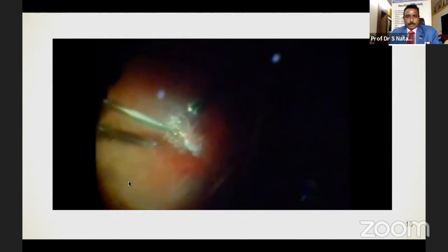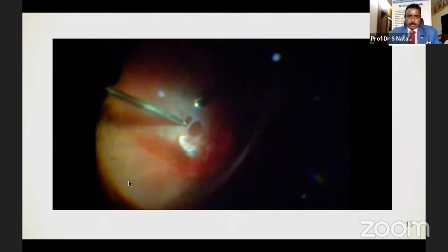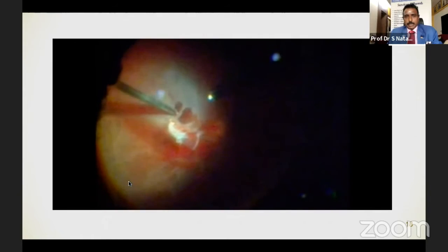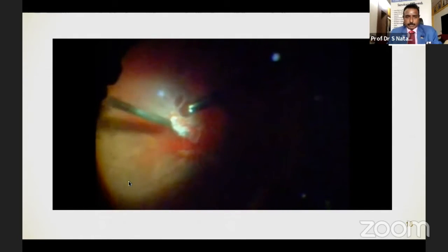So the airtight, watertight incisions are done. The cataract helps, and also in making the port. Here I'm doing the diathermy of the fibrous tissue, and you can see a rhegmatogenous combined retinal detachment. So I'm also diathermizing the edge of the break. But right now I'm diathermizing the fibrovascular proliferation, and I'm delineating the fibrous tissue from the retinal detachment.